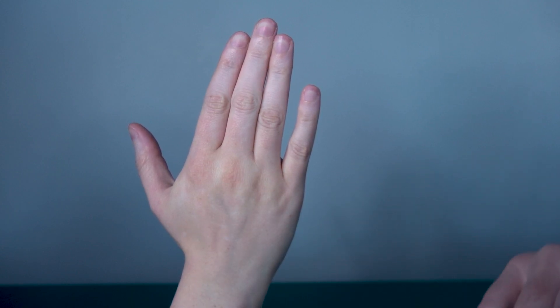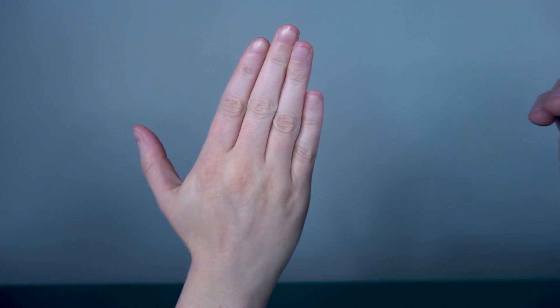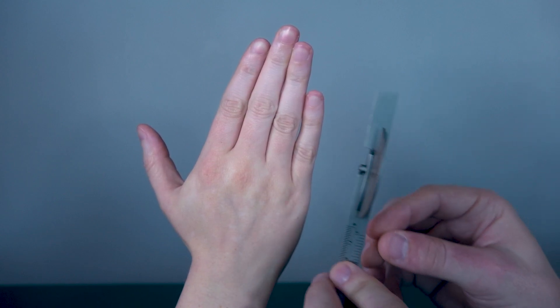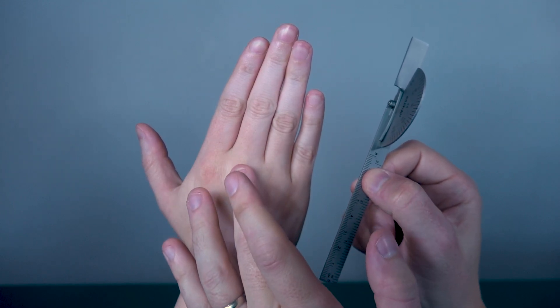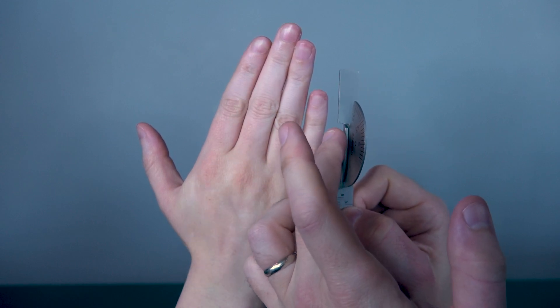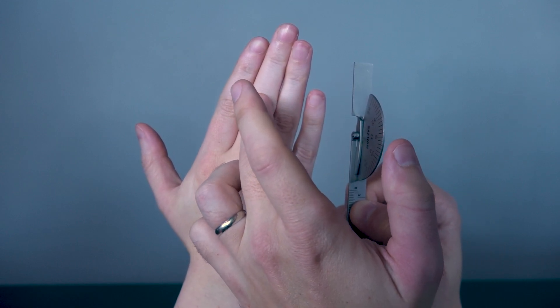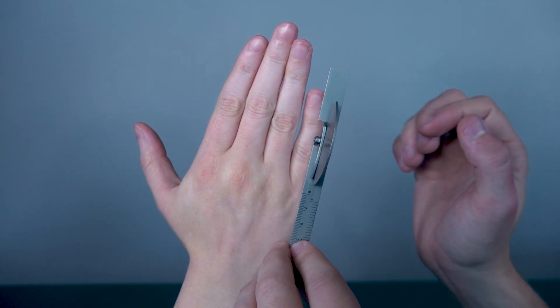When measuring extension, it will be identical to measuring PIP and DIP flexion. The same process will happen. You will have your stationary arm of your goniometer on the proximal phalanx, your movement arm on the middle phalanx, and the axis on the PIP joint.